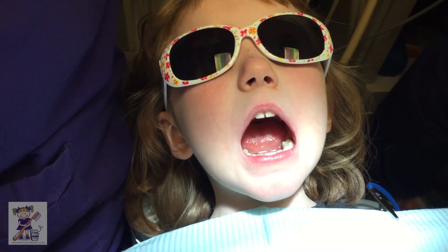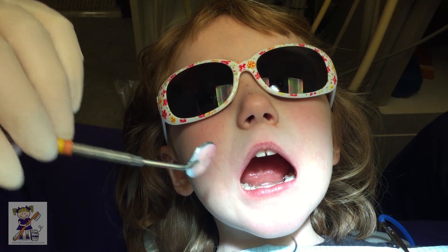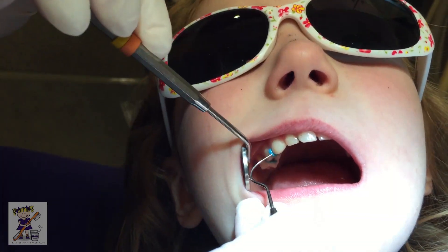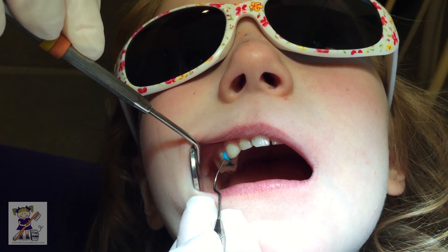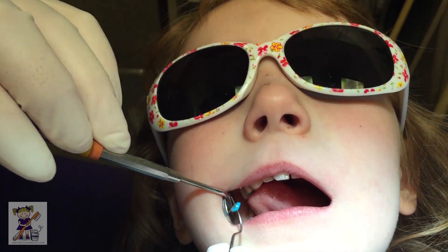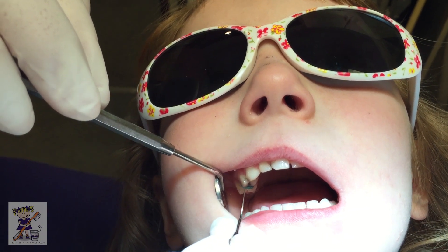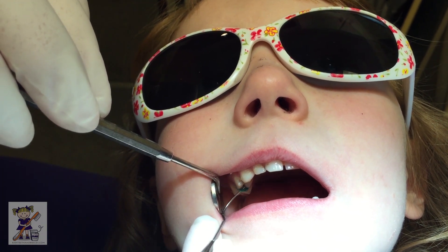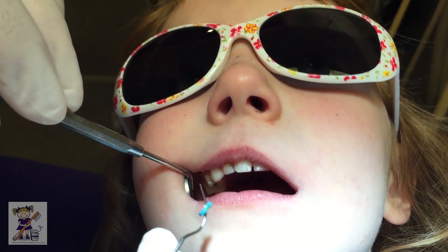Okay, you ready? We're going to take them out. Let's start up here on the top right first. So I'm going to take out the little tooth jewelry, the little rubber bands. I don't think I've ever heard of that before. There's one. Boop — it jumped! That was exciting. And then we're going to take out another one. It does sound like Mary Poppins, huh? There we go. Boop. Perfect.